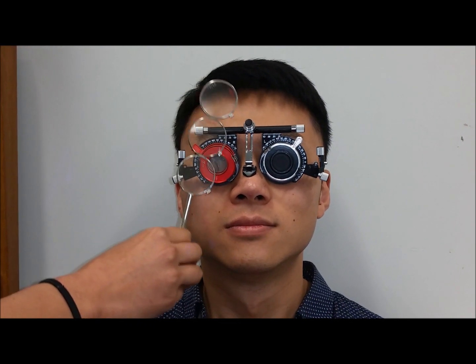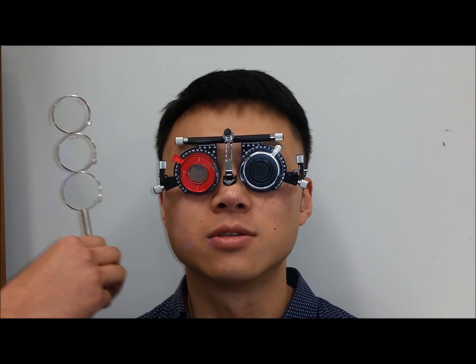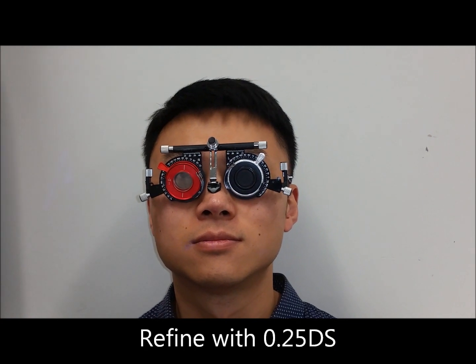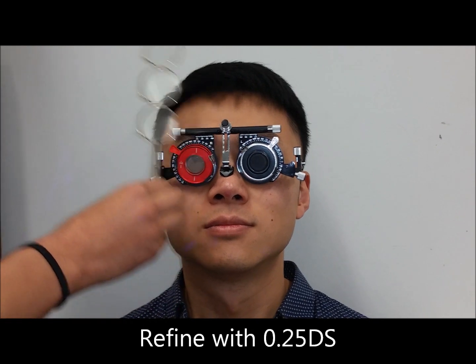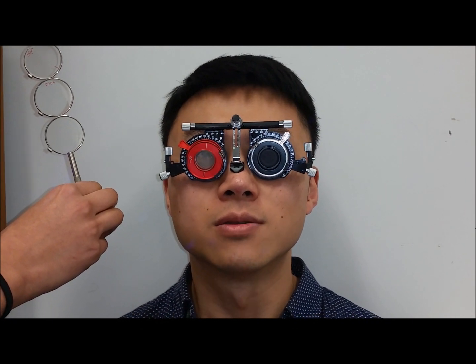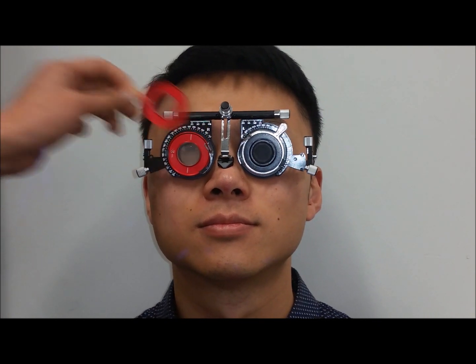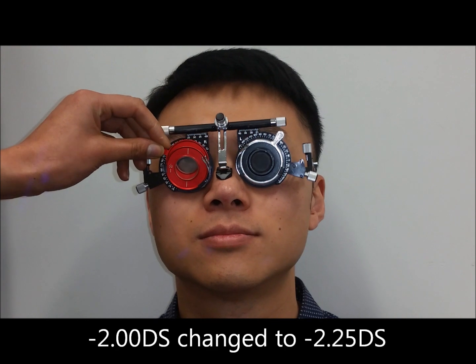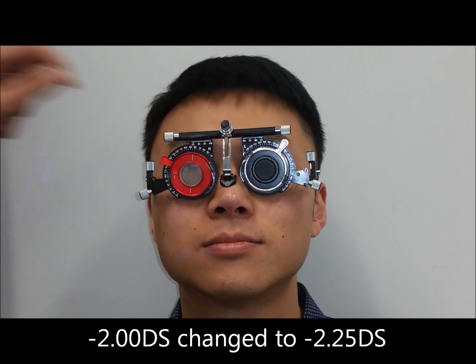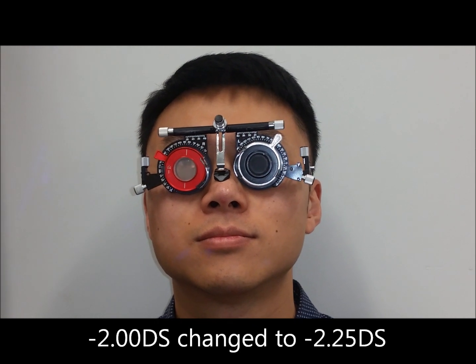Yep, and again at that A, is it better with or without? Better without. And again, just tell me, is it better with or just smaller and darker or better without? It's better with. Natasha will now change the spherical lens from -2 to -2.25, as Hongbin prefers an extra -0.25 diopter sphere.